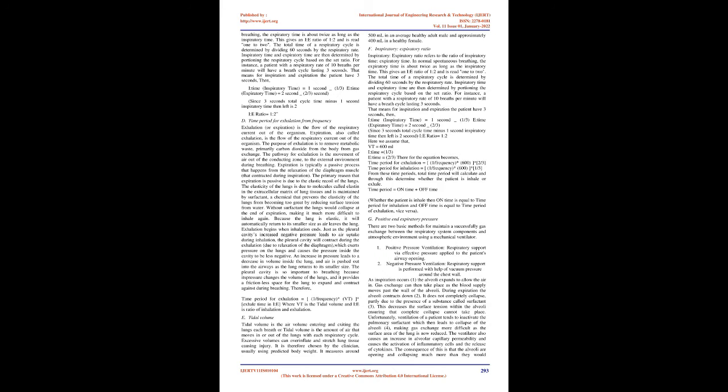We are developing a ventilator system equipped with a pressure sensor, alarm relay, and a pulse oximeter. The whole system consists of components like microcontroller, buzzer, LCD display, potentiometers, and LEDs. The main controller of the ventilator is an Arduino board and a pulse oximeter.